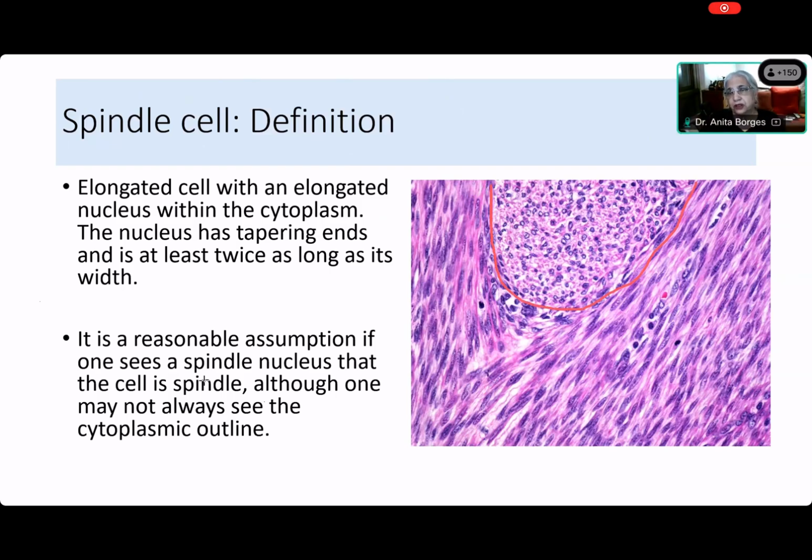So what is a polygon? You had a nice lecture on polygonal cells. So why do you call these polygonal? Yeah, ma'am. They're not, right? And really, you're not talking about the cells, Shashank. You were talking about the nucleus. Am I right? Yes, ma'am. All right. So now you tell me, what is this that you are seeing in this otherwise spindle cell lesion? I have outlined it, and I'm doing it again, so that nobody has any doubts about what Shashank is talking about.